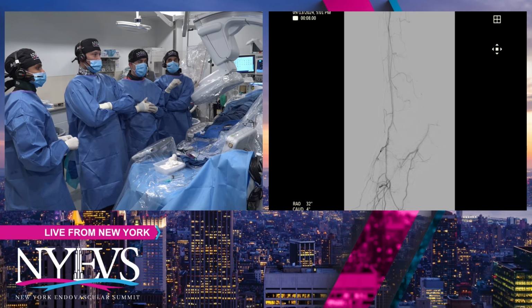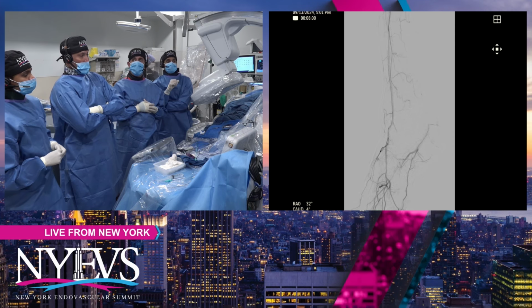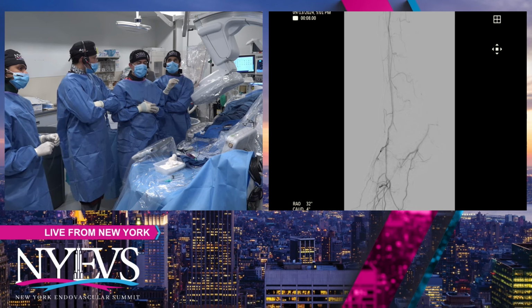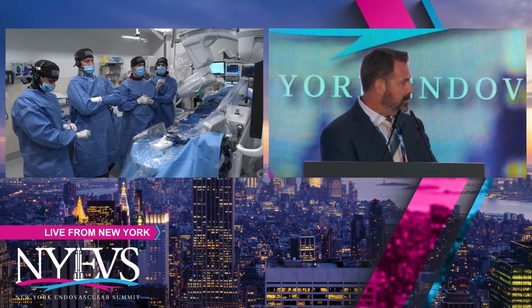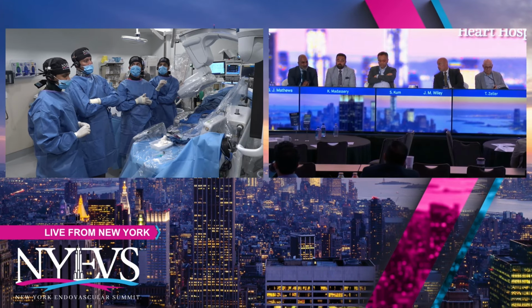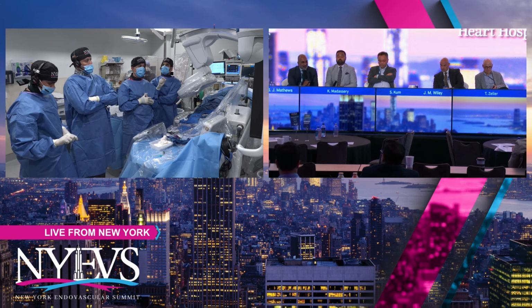So you want to make sure that, especially in a lesion like this, it has such a high degree of possibility of embolization. It's very important to see that your final product is good. Jay, any final thoughts? We'll just go down the line. No, I think this is a tough patient, right? So anything that we do is going to be really challenging, and the runoff is problematic, but I think this is the best option we got right now, too.